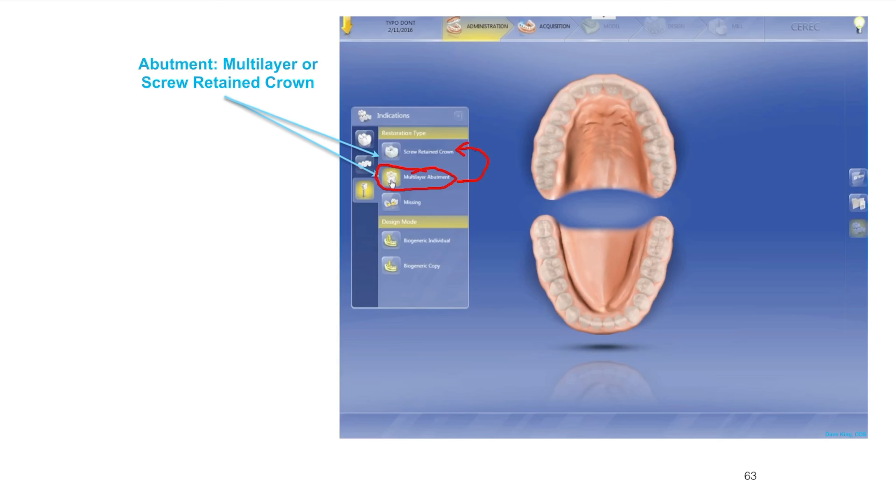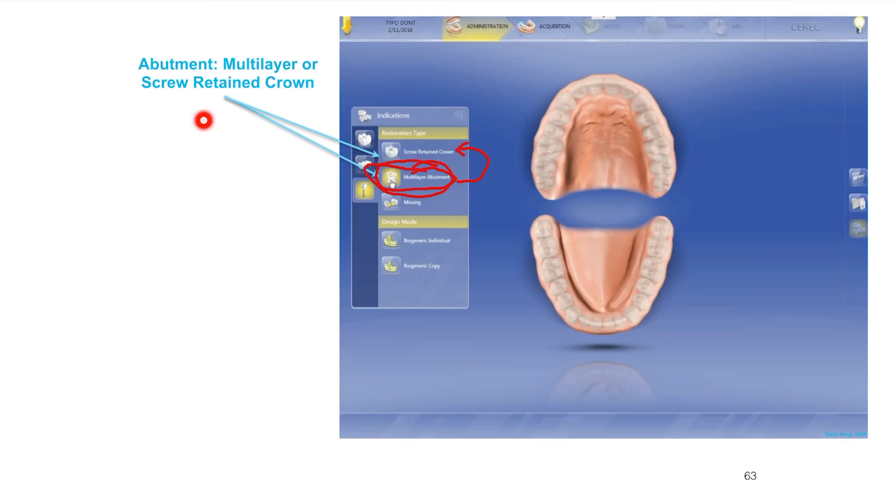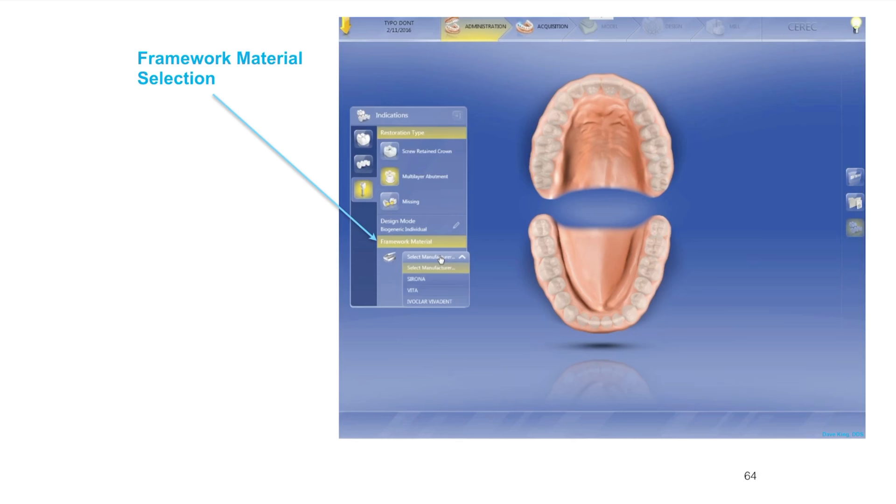I usually set it up as multi-layer so that going forward it allows me to get to the very end and then make that choice, rather than having to go back and do other steps. Make sure when you're setting it up that you make this determination beforehand. I usually set up every case as multi-layer as indicated here, and then I have the option of leaving it as screw retained and not splitting it out.